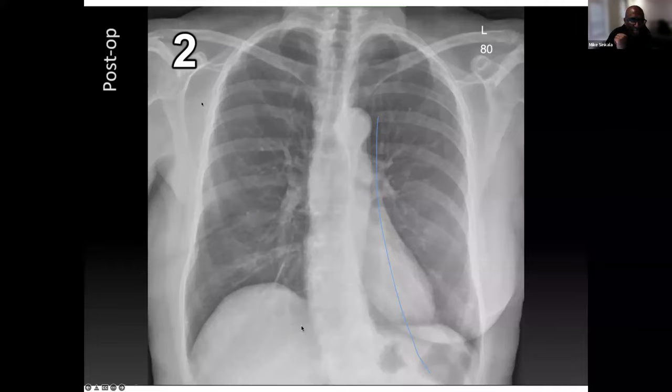Notice also here that we do have some surgical clips, meaning that the patient has had surgery in the past. So when you see the presence of these surgical clips and no breast shadow here, this should prompt you further to start looking for destructive bone lesions. You might see a destructive bone lesion, maybe the humeral head is being eaten away, or you may see some metastatic deposits in any of these bony structures around here, or you might see a pathological fracture through the humerus there.